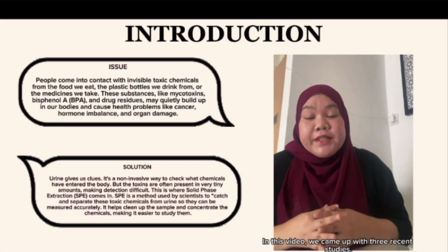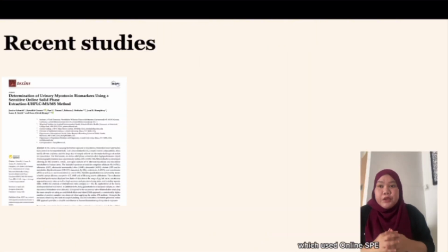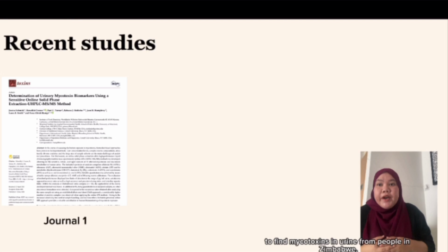In this video, we came up with 3 recent studies. The first study is from Rahman et al., 2021, which used online SPE to find mycotoxins in urine from people in Zimbabwe. The result shows the toxins from moldy food that can be very dangerous.